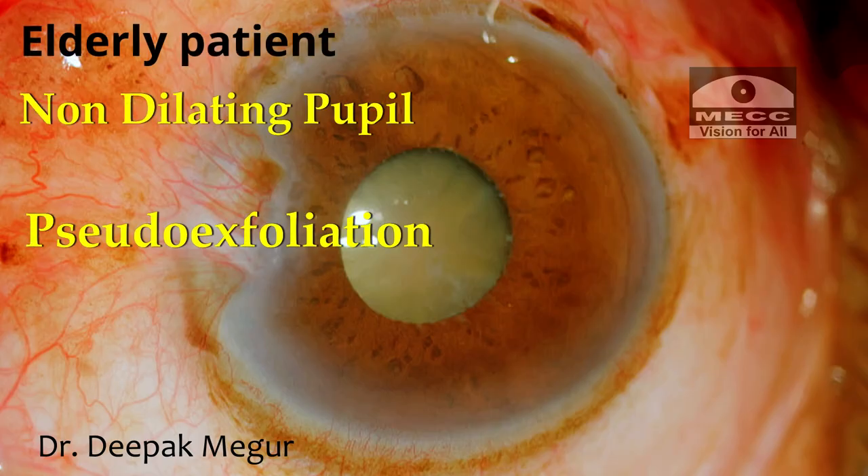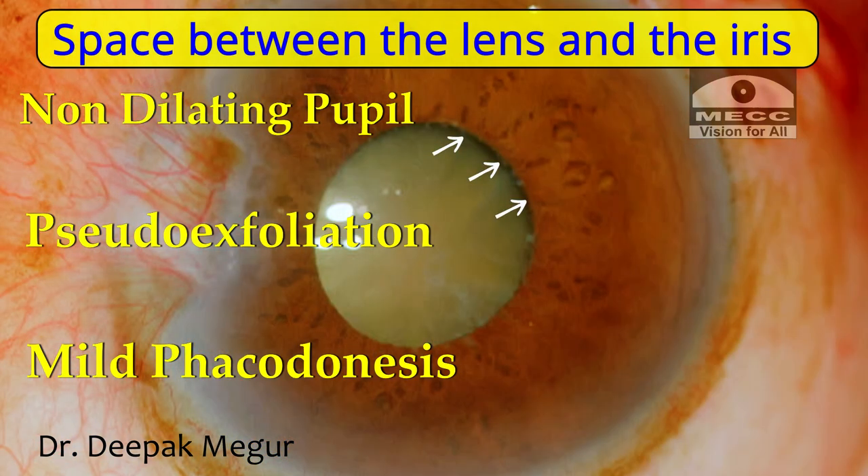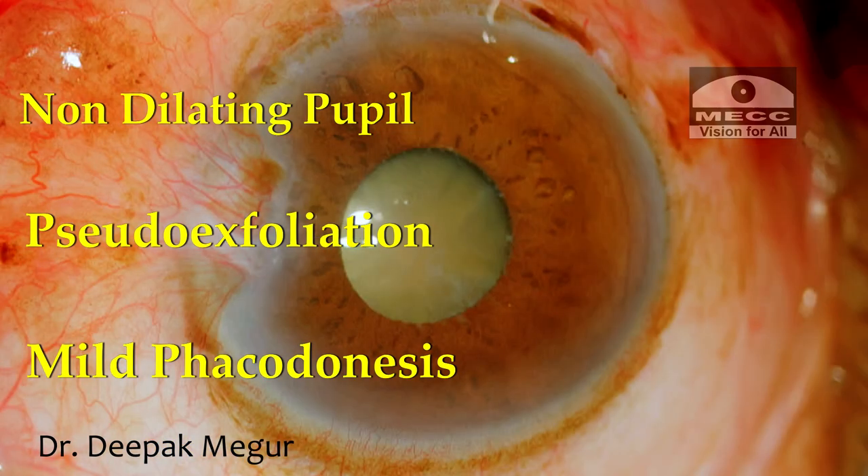This is an elderly patient with multiple complexities: non-dilating pupil, pseudo exfoliation, loose zonules, bulky nucleus. It has mild phacodonesis as well.